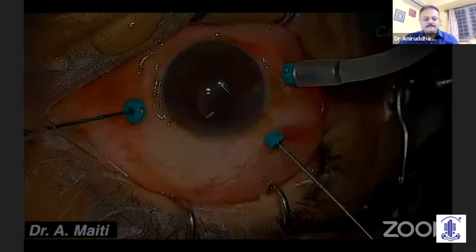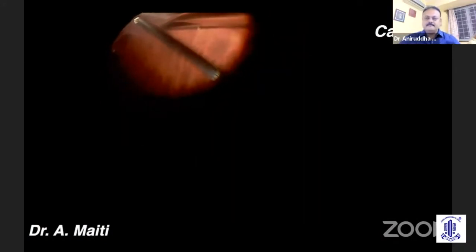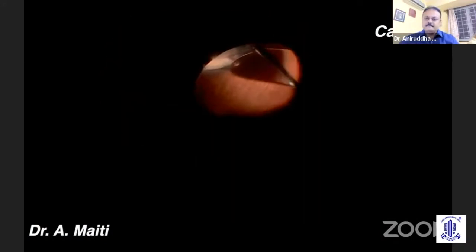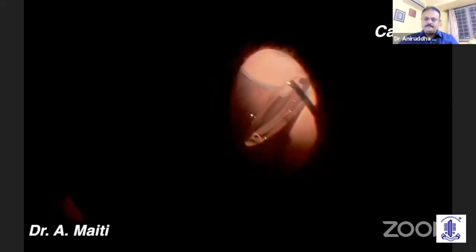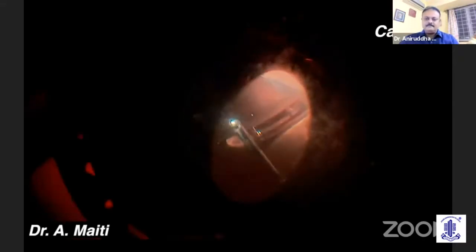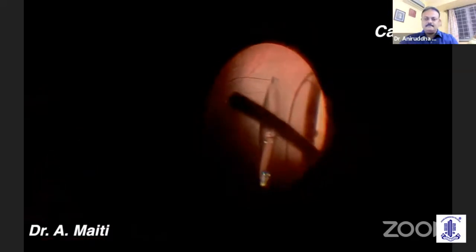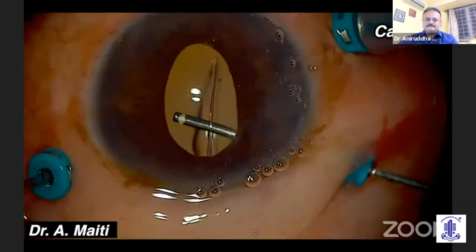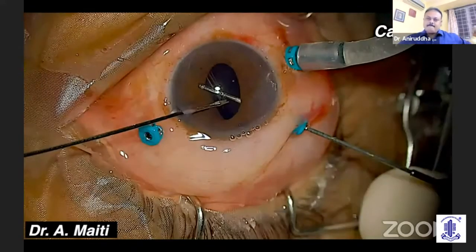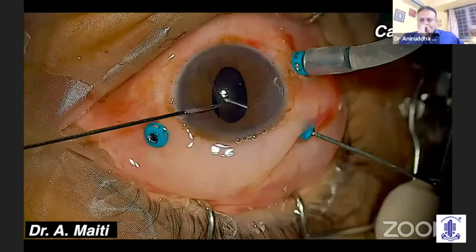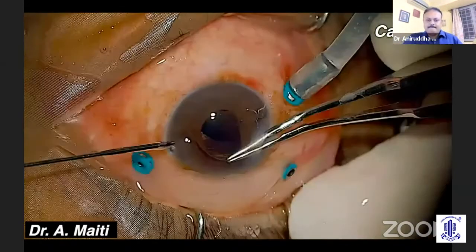Case 1 was a case of a simple dislocation of an IOL. I started with core vitrectomy and then peripheral vitrectomy to make sure that I did not drag any vitreous strand while taking out the dislocated IOL. I pulled out the IOL with the cutter till I reached the pupillary plane, and then with the help of a forceps, I pulled out the IOL into the anterior chamber.